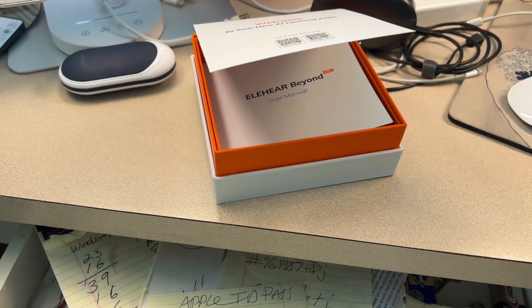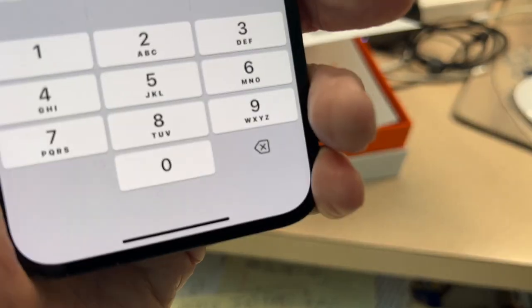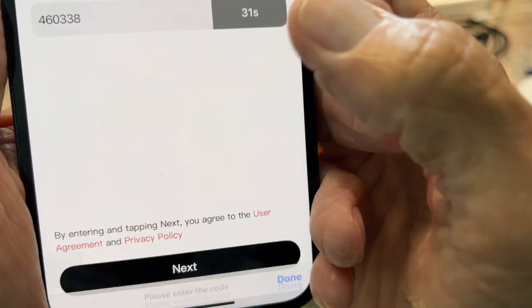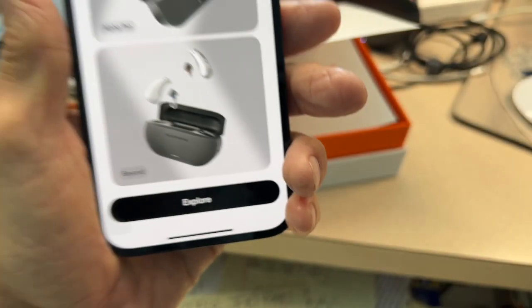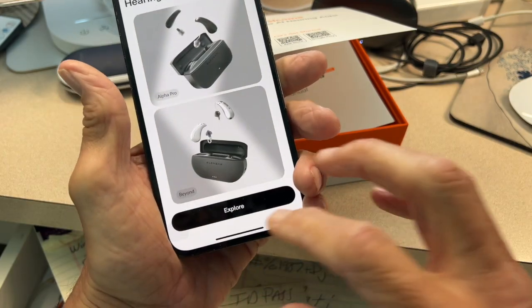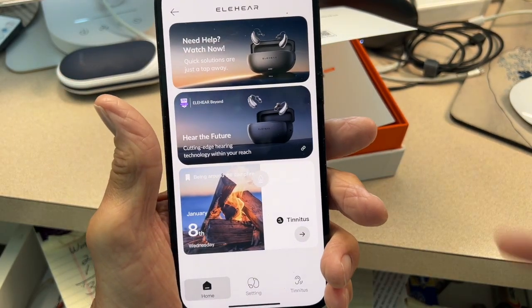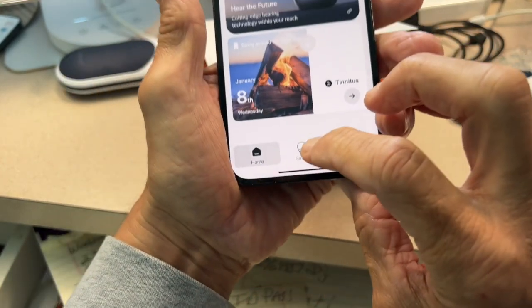I got to go find my code. I got to go to my email, right? All right. So I got the verification code and I put it in. I'm just going to hit done. And then now I hit next. And now it just says explore. All right. It says need help. Watch now. Hear the future. All right. Here's your settings down here.